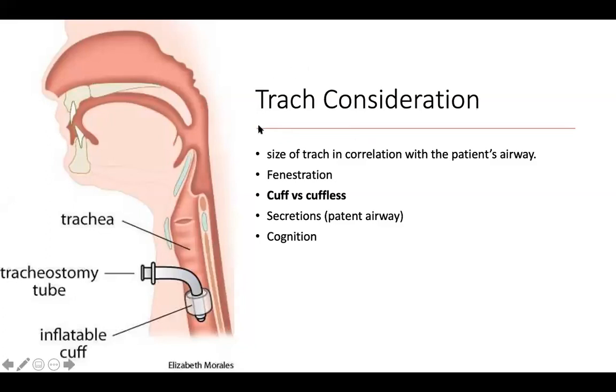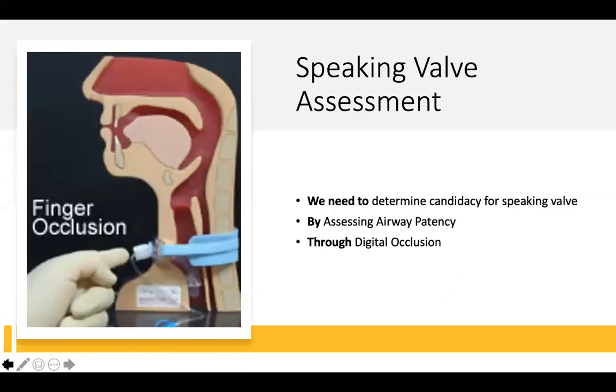Okay, so what to consider when putting on a speaking valve. The most important thing is to restore that upper airway mechanism to allow air to go back up. Oops, sorry, I keep doing that. Okay.